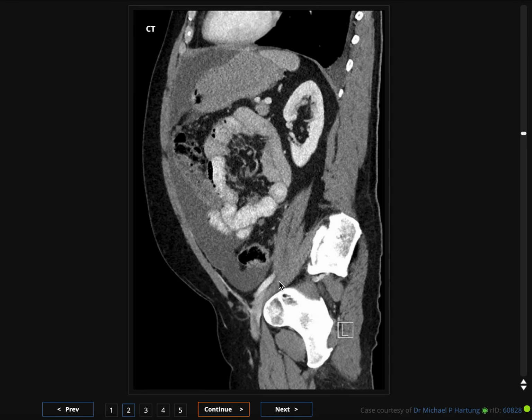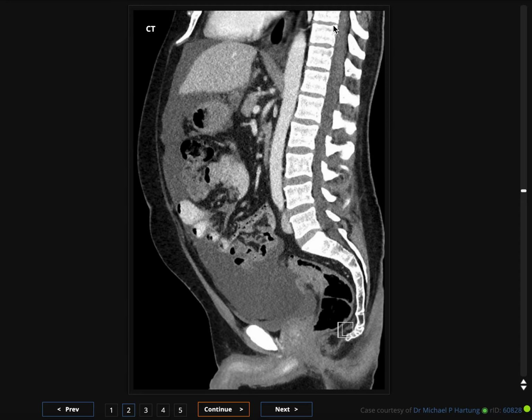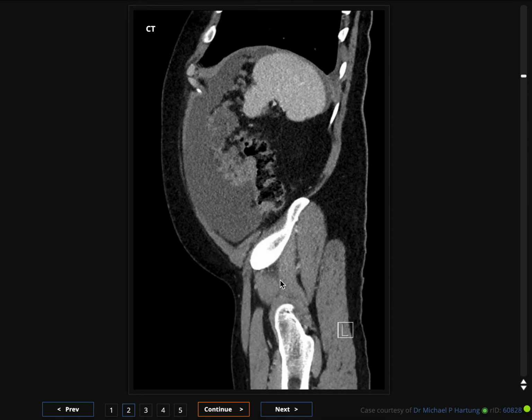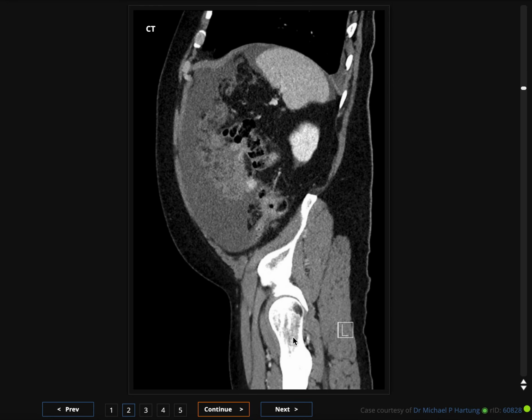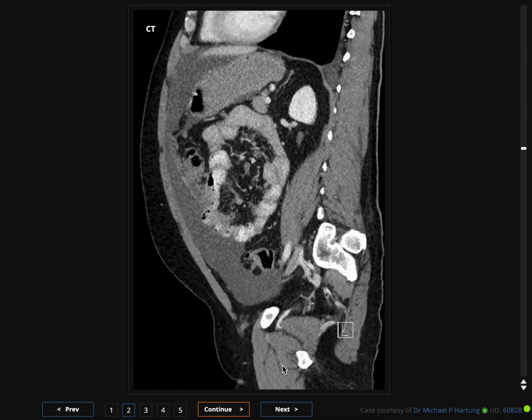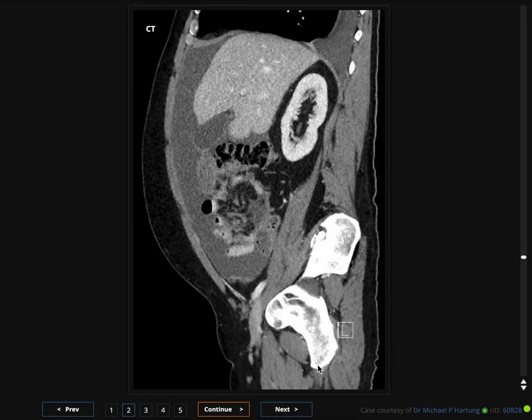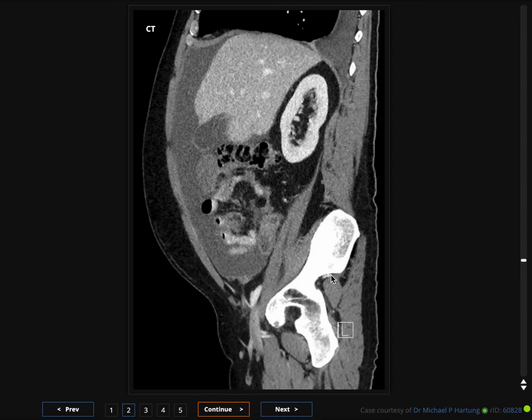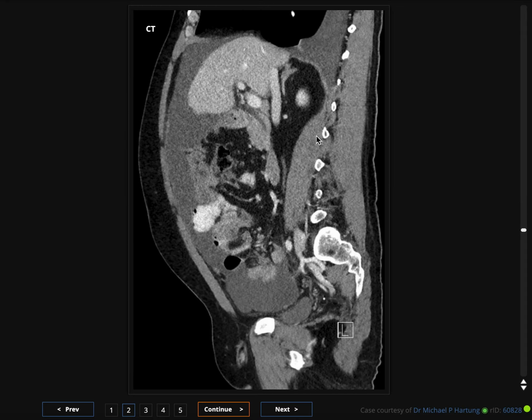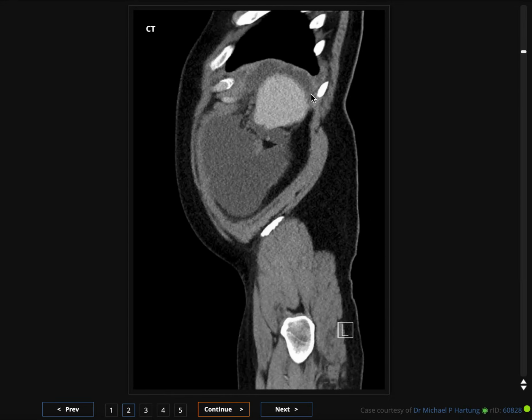Now the other part of the CT would be I would look at every organ carefully. I would look at the bones to see if I see any bony metastasis. I'm unable to window and label this, but when I quickly scroll through, I'm looking at the femur, superior pubic rami, pubic body. I'm coming to the ischium. Let's go on the other side. Nothing here at the femur. Let's come down to the spine. Nothing really jumps out at the spine. Let me quickly look at the ribs. Nothing in the ribs.